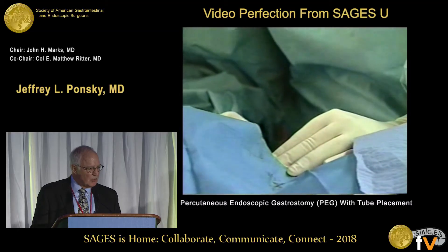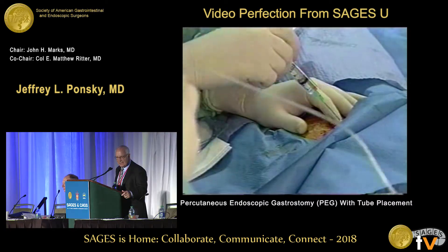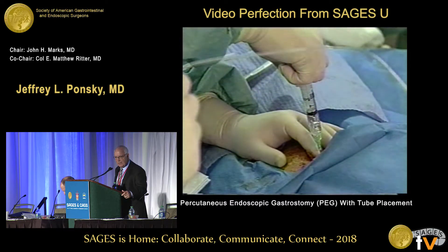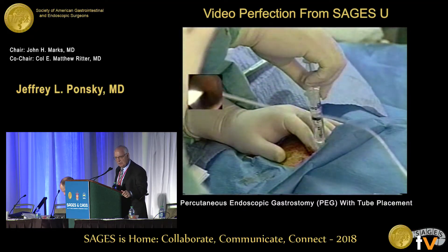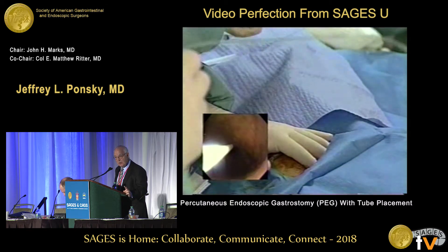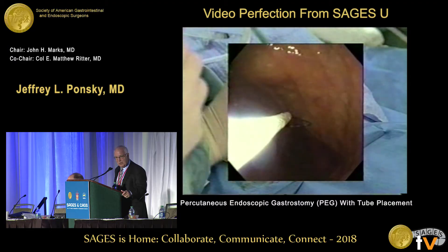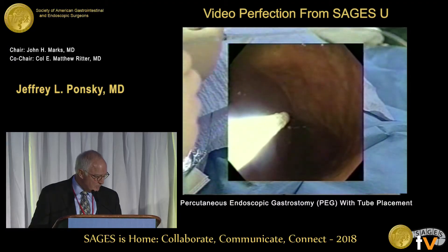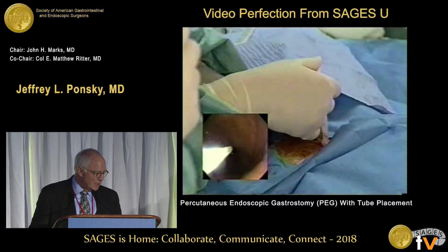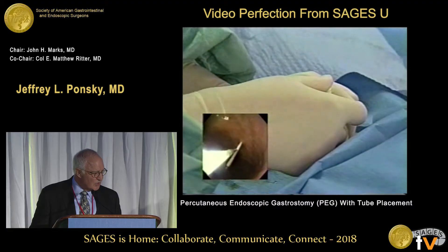What we're going to do now is called the safe-track method, and the safe-track method keeps you out of trouble. We take that needle and go perpendicular, advancing very slowly, and aspirate looking for air. We should see air appear in the syringe at the same time as the needle appears in the stomach. If the syringe gets air in it before you see the needle in the stomach, you're in the wrong place — take the needle out and pick another spot. We pass that needle in with the snare waiting to catch it. It's a very simple technique: you thrust the needle in, and with the snare waiting, you just catch it right like that. If you don't catch it, catch it again.